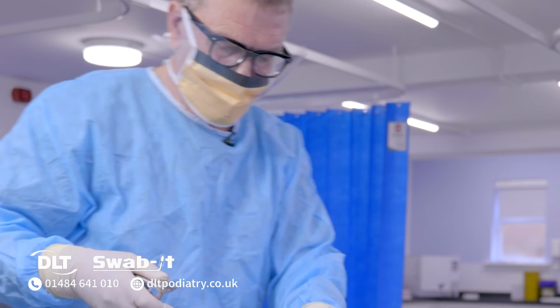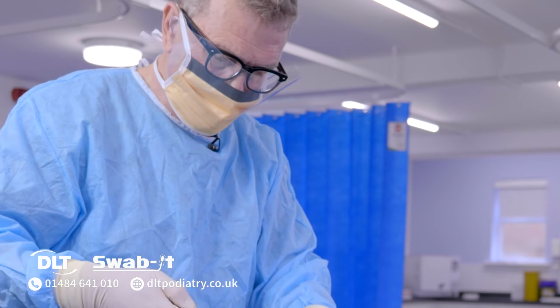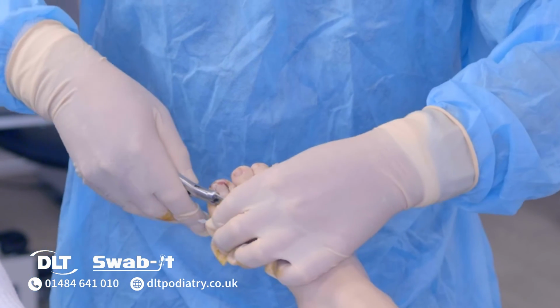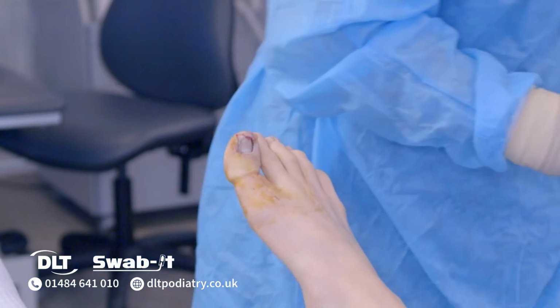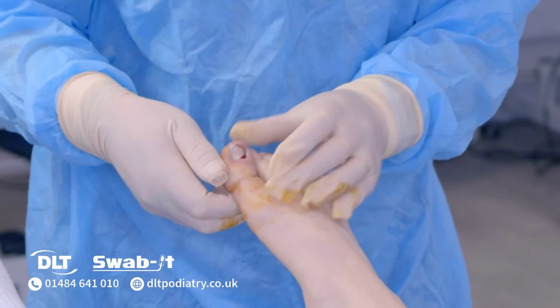The next best thing is to remove the tourniquet before you do anything else, because that's where most of the risk is, in leaving that on. And as you can see, you can then see if it's bleeding.